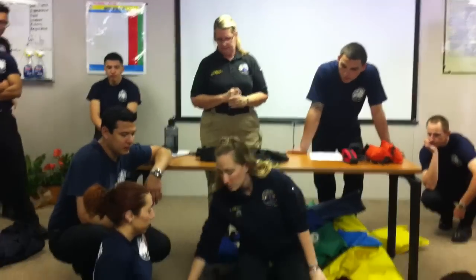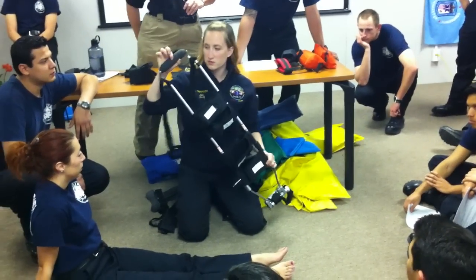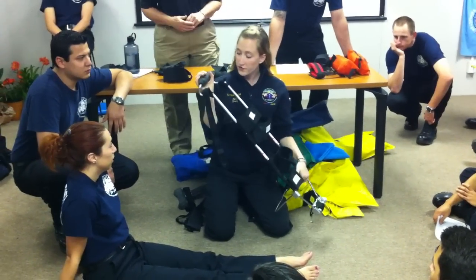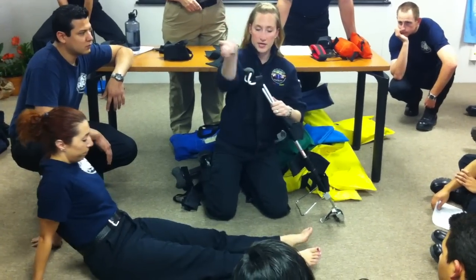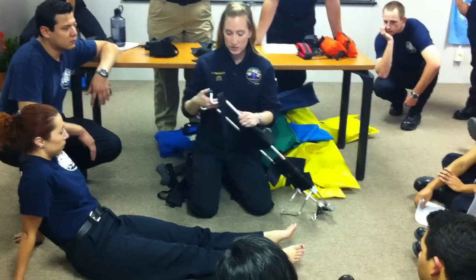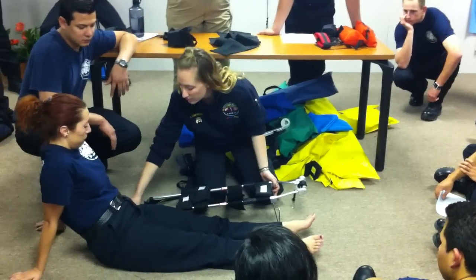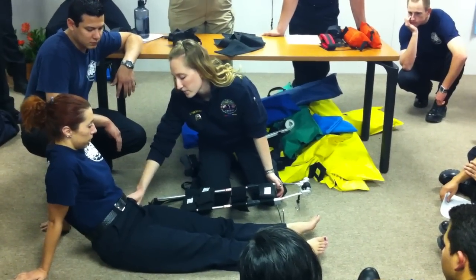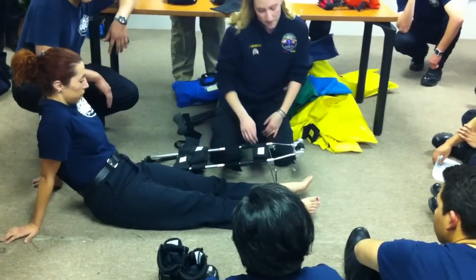Okay, so this one goes up underneath your butt cheek. You'll have to manipulate the leg up while someone is pulling traction, so you can slide it underneath and it goes in that crease. Then you measure it to where it needs to go to their foot. You feel where their pelvic bone is, so right about there. So I can gauge that's where it's going to go on her.